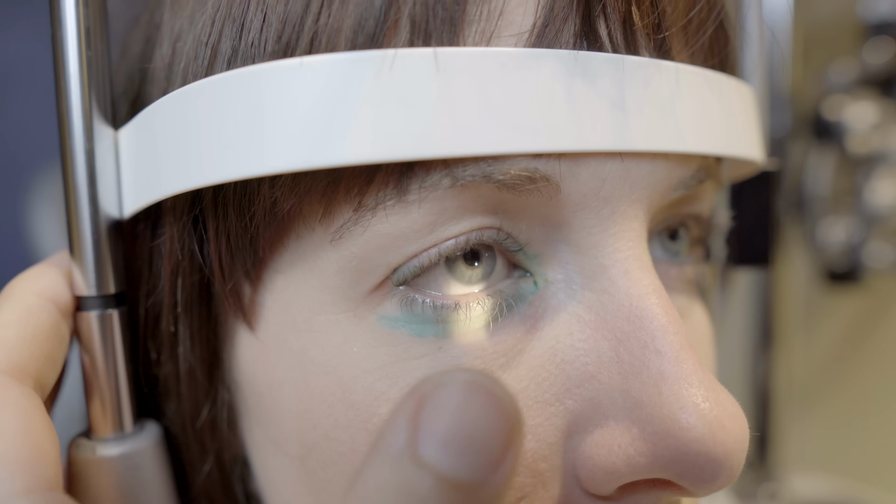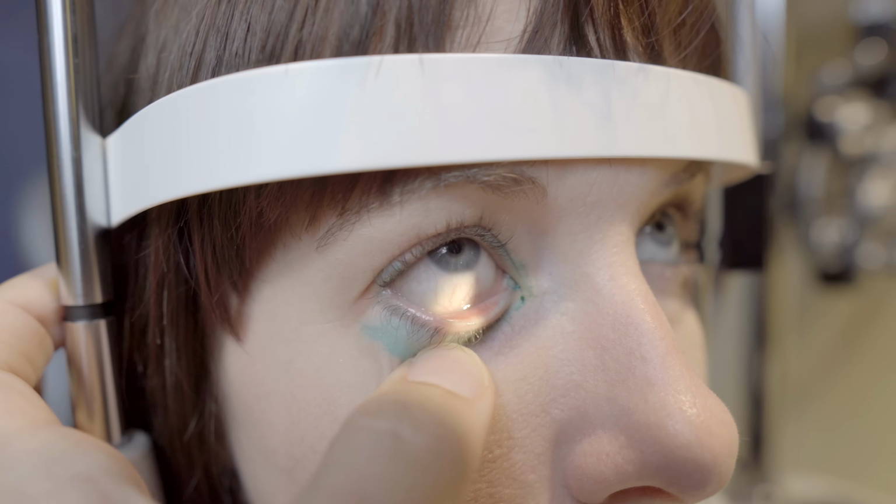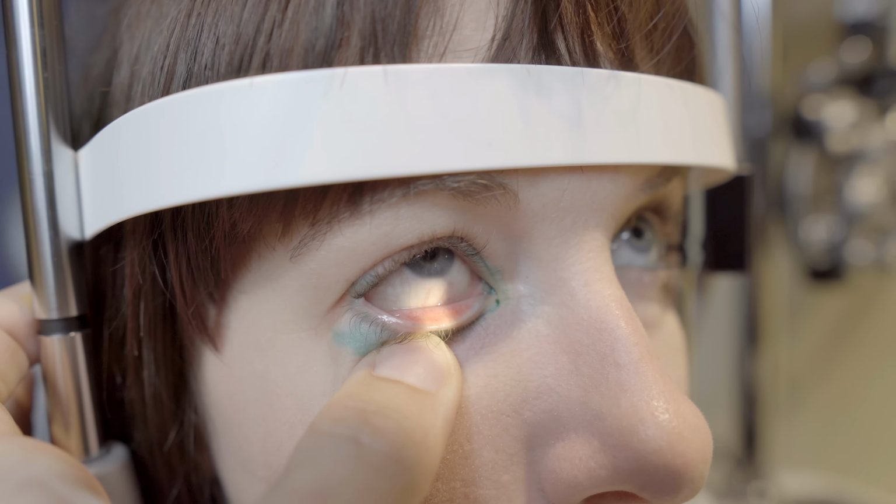And with all the staining, your doctor is also observing for deformities of the cornea, such as scarring, post-surgeries, as well as corneal dystrophies, for example. Any scenario where the front surface of the eye is not normal or regular. Now, outside of just looking at the front surface of the eyeball itself, a big part of this examination is also looking at the eyelids.